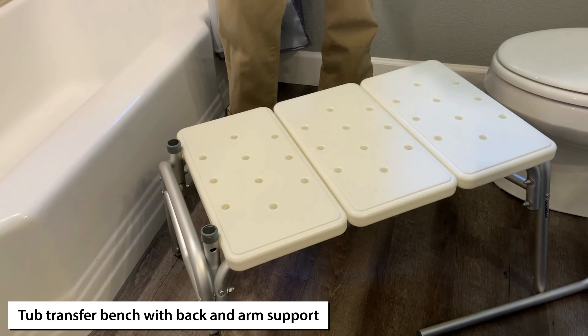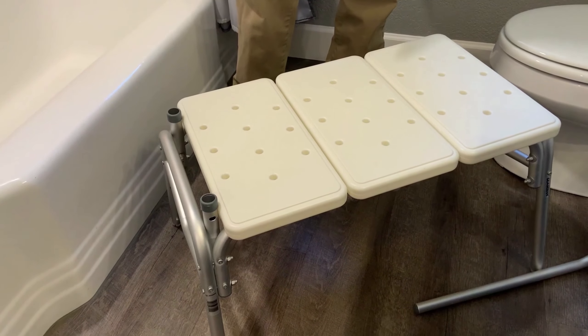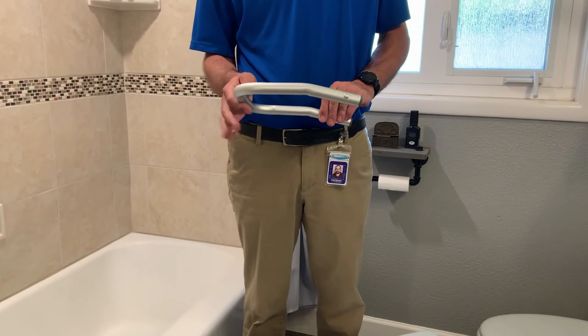You've received your transfer bench. We're going to show you how to set this up and install it into your bathtub for use. In your kit you'll have a few different things.